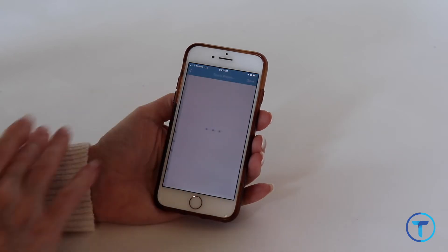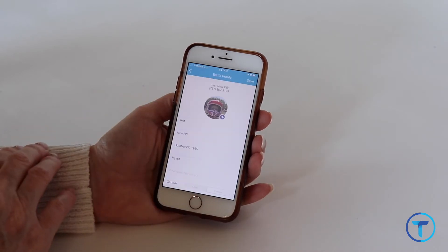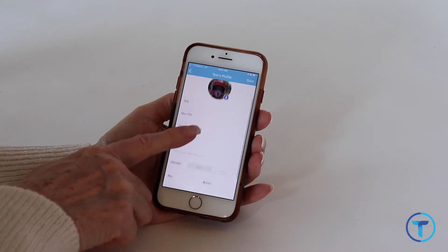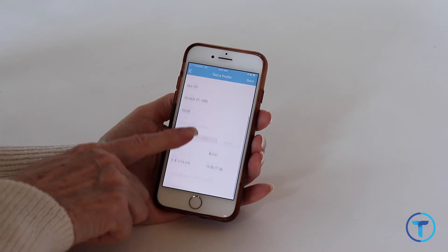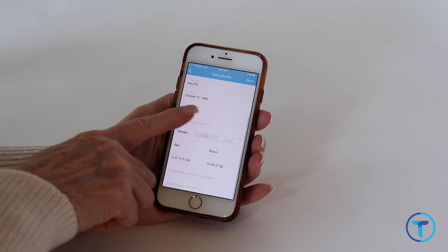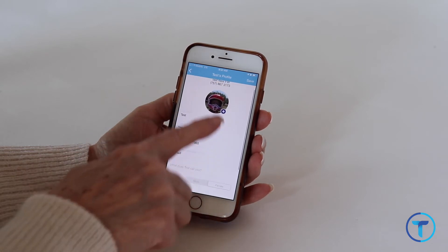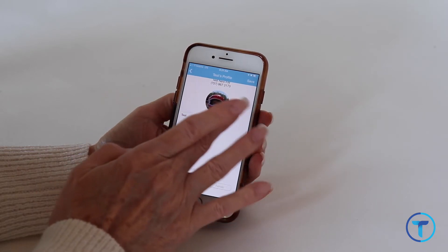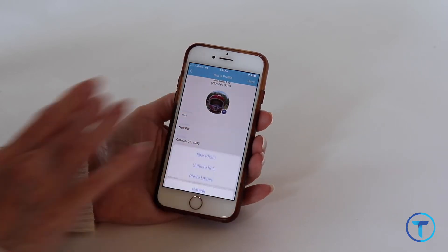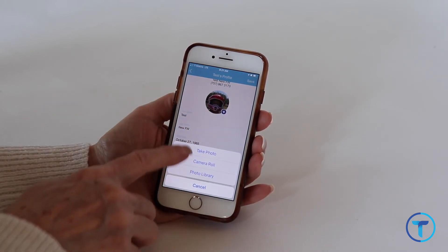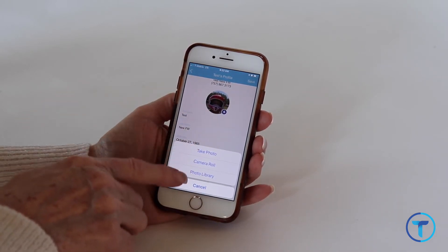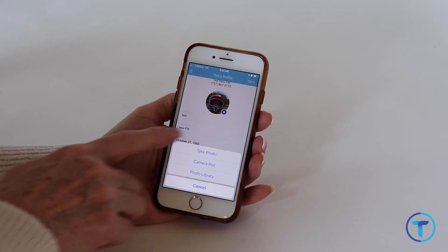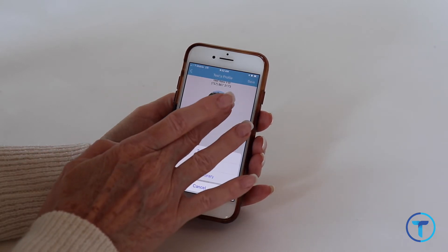The yellow profile icon is where you edit everything about your loved one who is wearing the watch — their name, birthday, gender — and you can even edit their photo. Just tap the plus sign and select where you want to pull or take the image from.